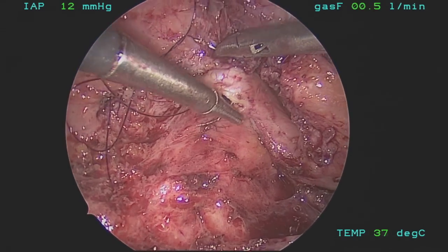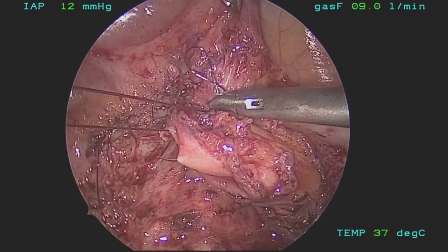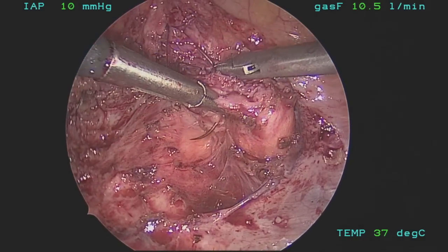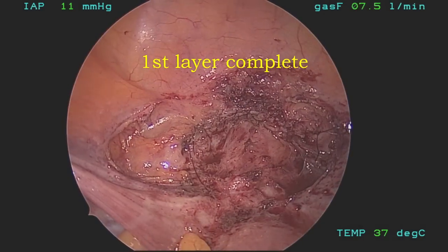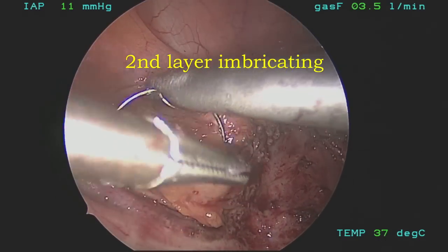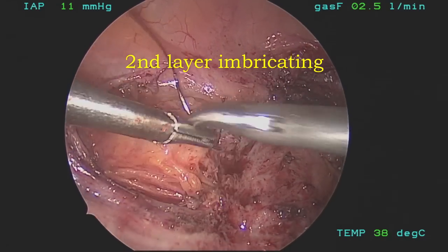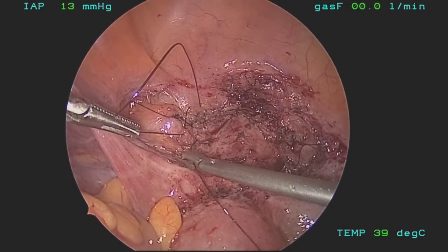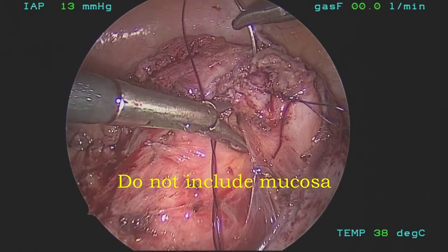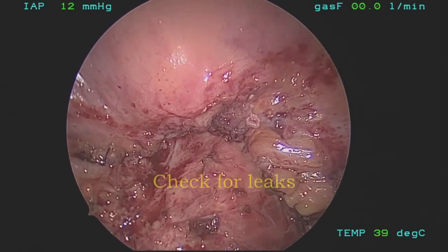Closure is continued in a running non-locking type fashion. As you can see here, the edges are approximating very nicely. Gentle tissue handling is very important. After the first layer is closed, a second imbricating layer is then performed utilizing the same suture. However, the mucosa is not incorporated in this layer. Now we are nearing the end of closure of the second layer.